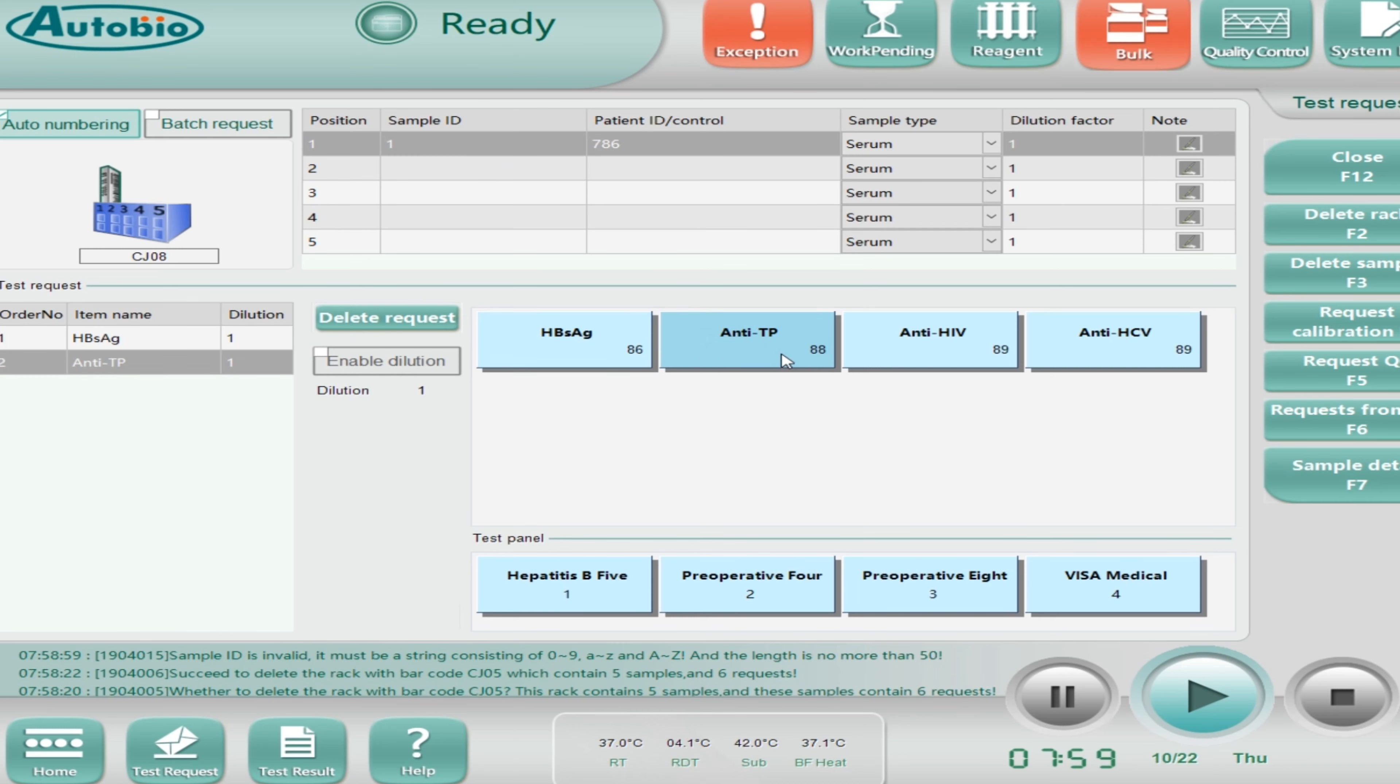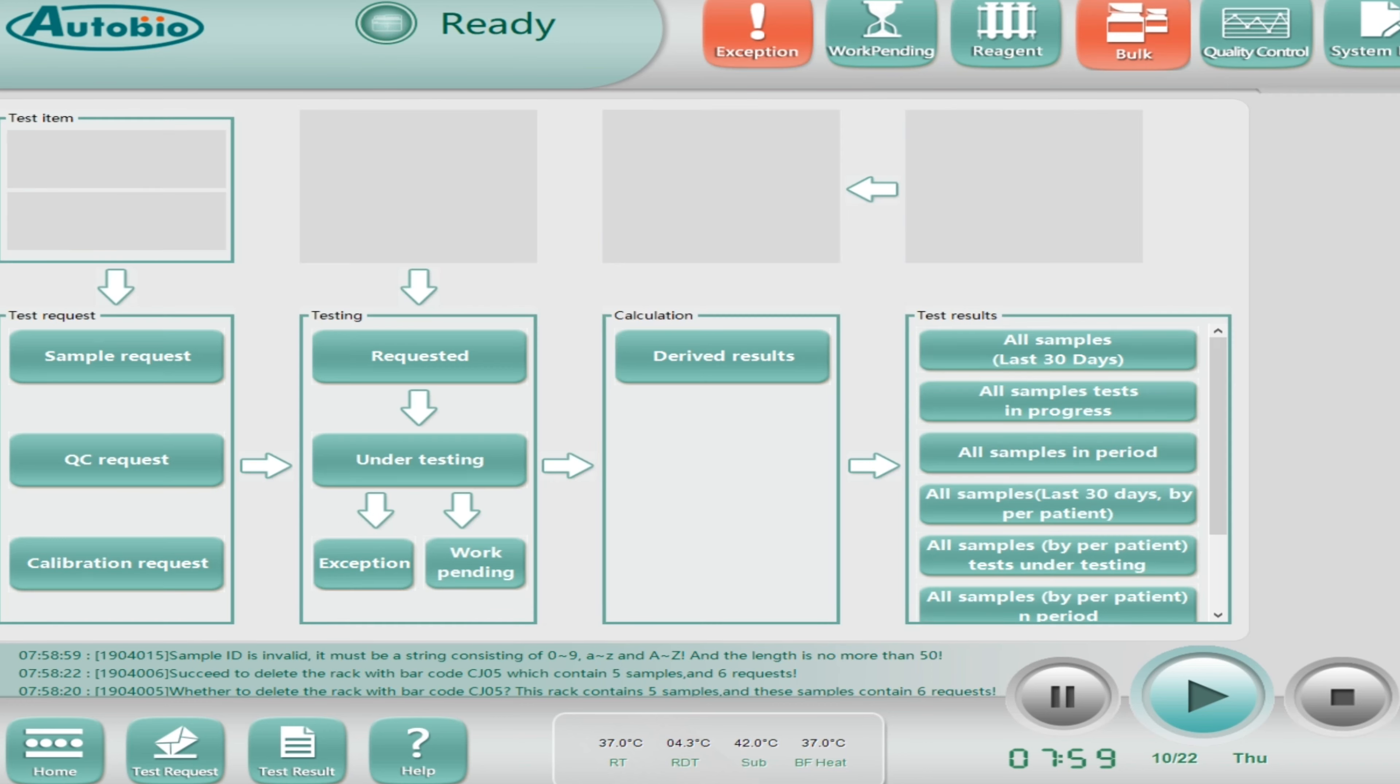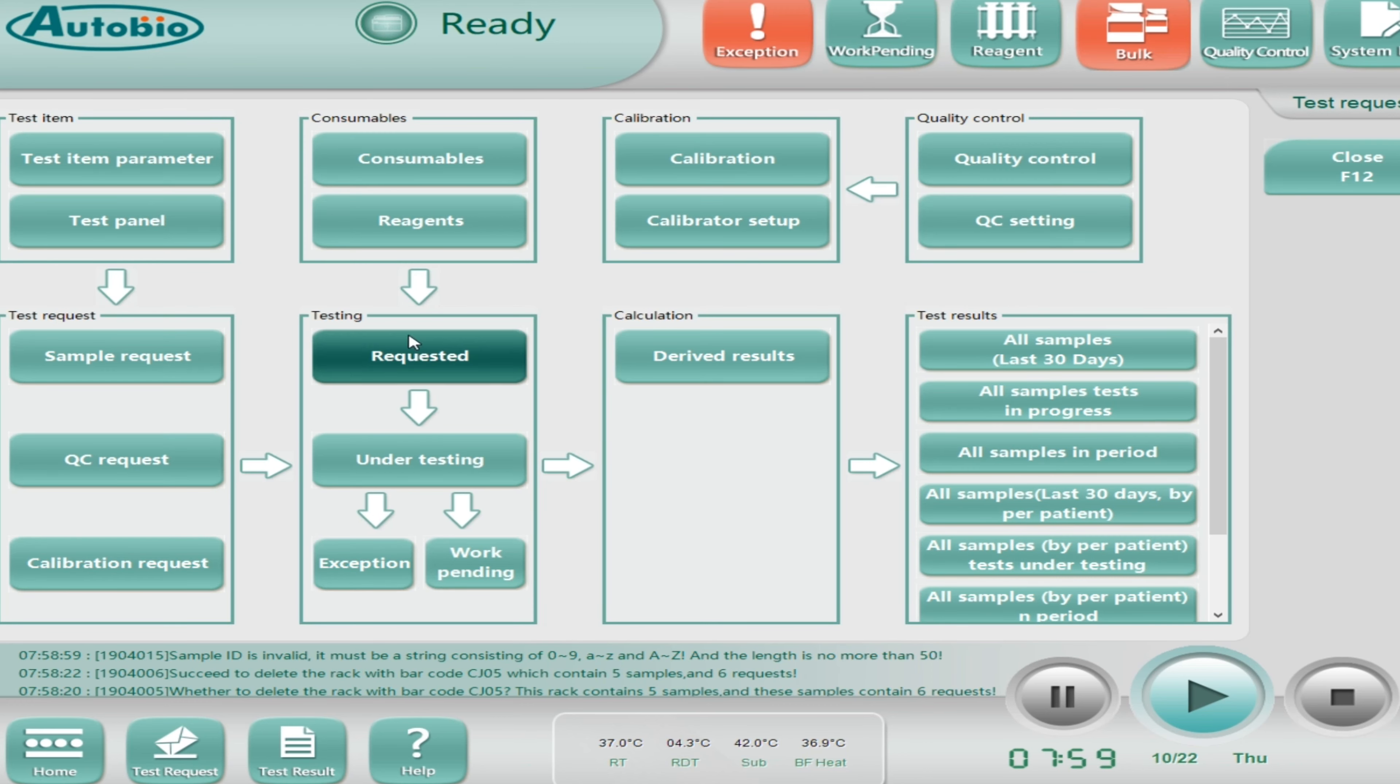Same way I'll show you how to run the calibration control. Enter, scan the rack, and select the test which you want to do the calibration.